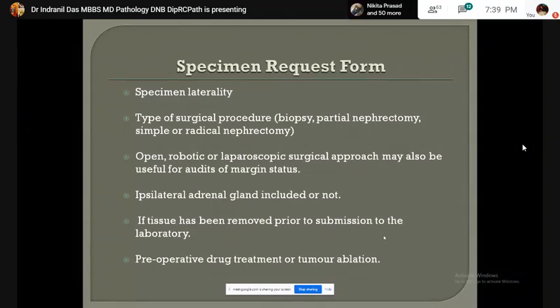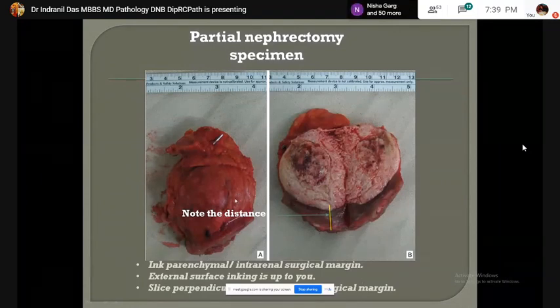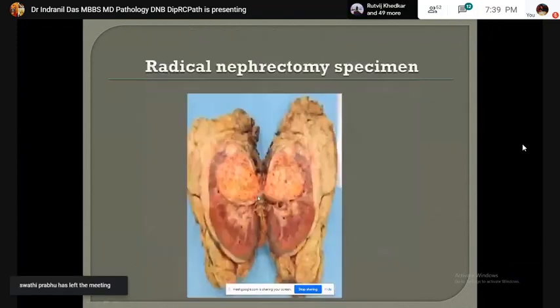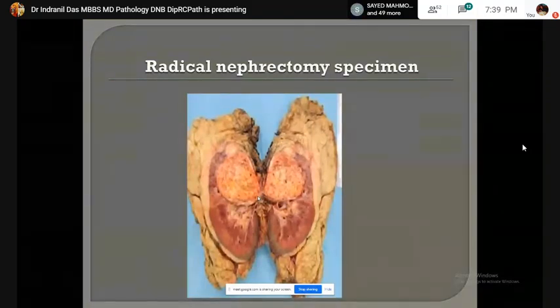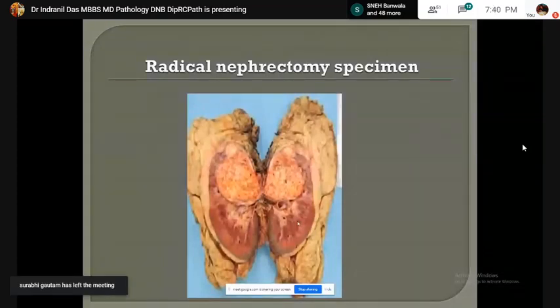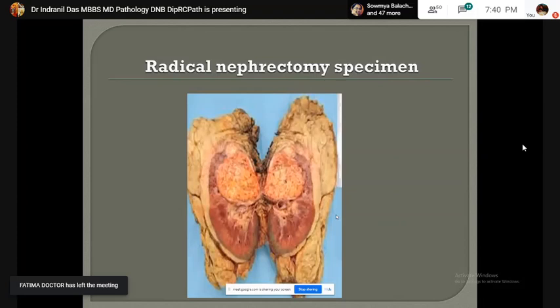Upon receiving a partial nephrectomy specimen, the parenchymal or intrarenal surgical margin should be inked. You can or cannot ink the perinephric surface. After inking is complete, the specimen should be sliced perpendicular to the parenchymal surgical margin. In this radical nephrectomy specimen, a well circumscribed yellow tumor extending up to the renal pelvis is noted near the upper pole.